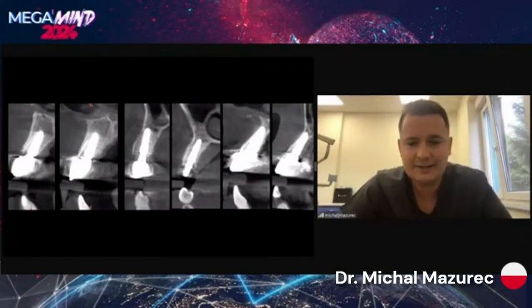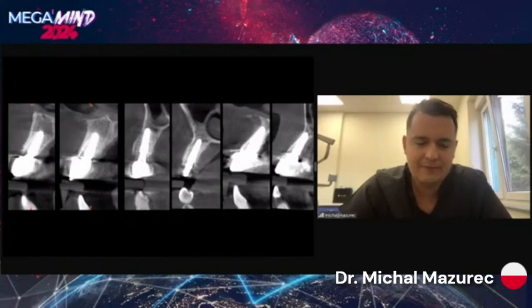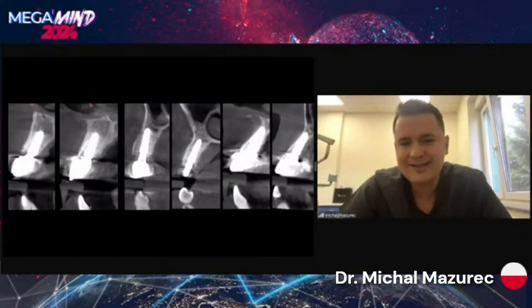I did everything guided. And what is the most important thing for me in the whole concept is that we have very good aesthetics, we don't need many procedures, and there is sound bone around the implant. So we are very, very safe in the long-term, because we are minimizing the risk of peri-implantitis from xenograft materials and from overgrowing soft tissue.